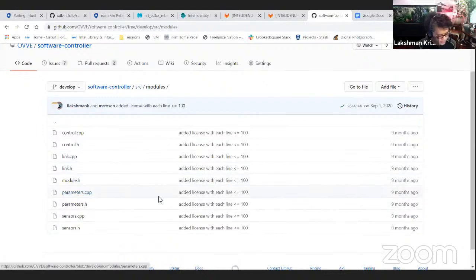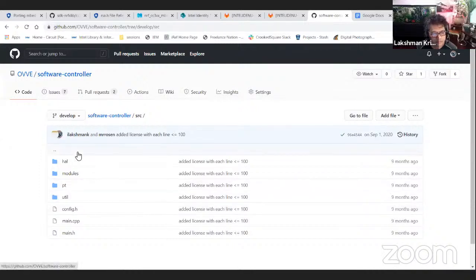The parameters module is intended to store, and serve as an intermediary and a check for, anything given by the Raspberry Pi as, set the various parameters to these. We also want to check them and make sure that they're stored and restored in the event of any kind of problem. That's what that module is for. And then lastly, the sensors module is responsible for getting the feedback from the pressure sensor and from the airflow sensor we have in our system in order to form a closed loop. So we'll look at those in a second, and then go over a few other pieces of the code on a higher level.